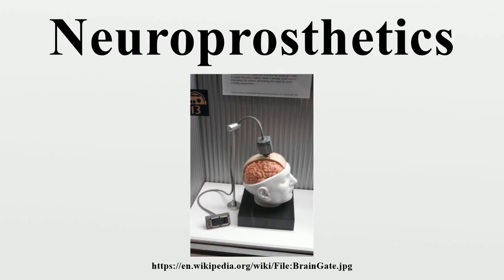Improved performance in cochlear implants not only depends on understanding the physical and biophysical limitations of implant stimulation but also on an understanding of the brain's pattern processing requirements. Modern signal processing represents the most important speech information while also providing the brain the pattern recognition information that it needs. Pattern recognition in the brain is more effective than algorithmic pre-processing at identifying important features in speech. A combination of engineering, signal processing, biophysics, and cognitive neuroscience was necessary to produce the right balance of technology to maximize the performance of auditory prosthesis.